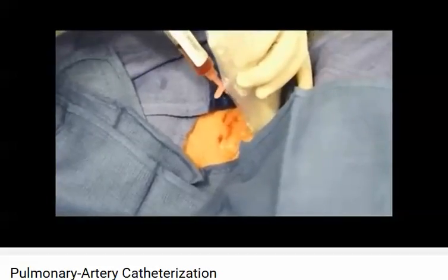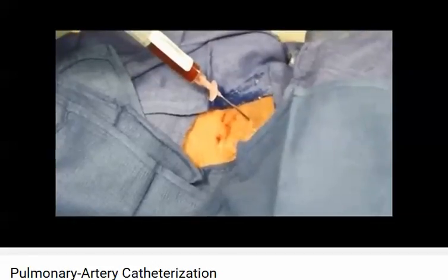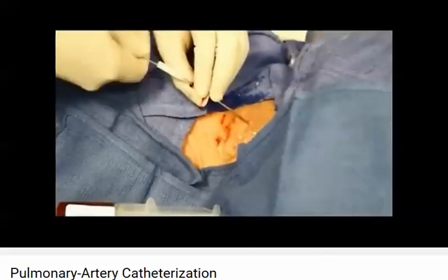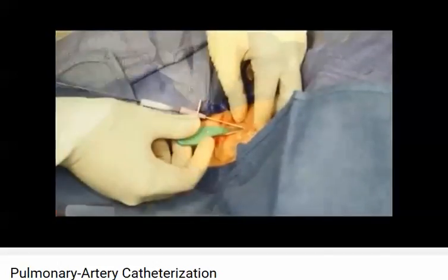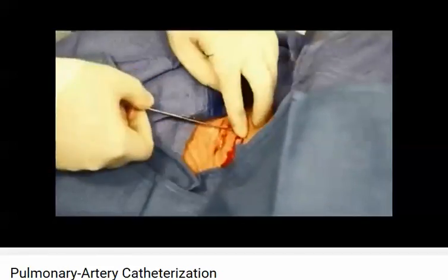If you are cannulating an internal jugular or femoral vein, use ultrasound to guide the needle. Once dark red, non-pulsatile blood is aspirated, remove the syringe from the needle and insert the guide wire. Use the scalpel to stab the skin adjacent to the needle and then carefully remove the needle.